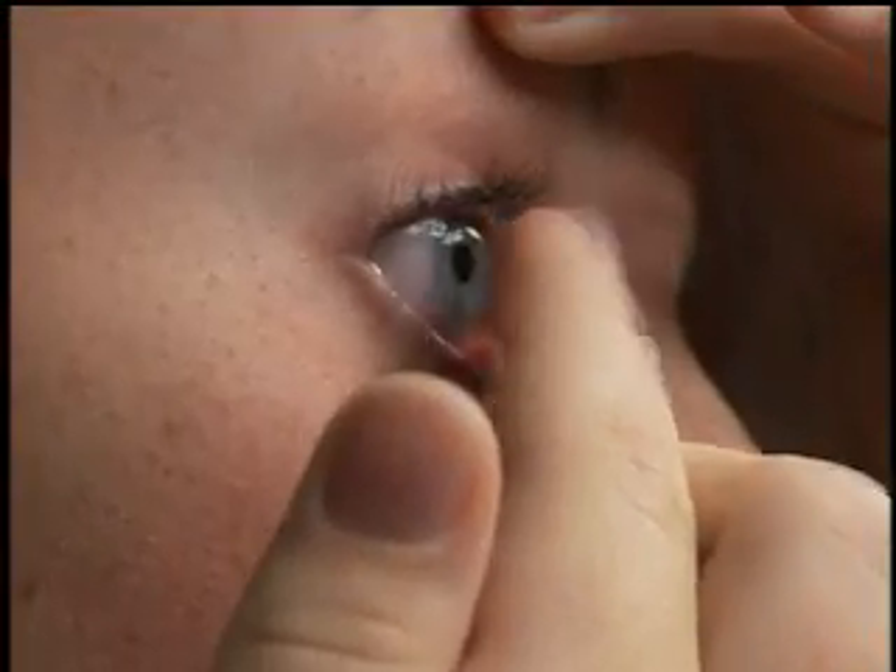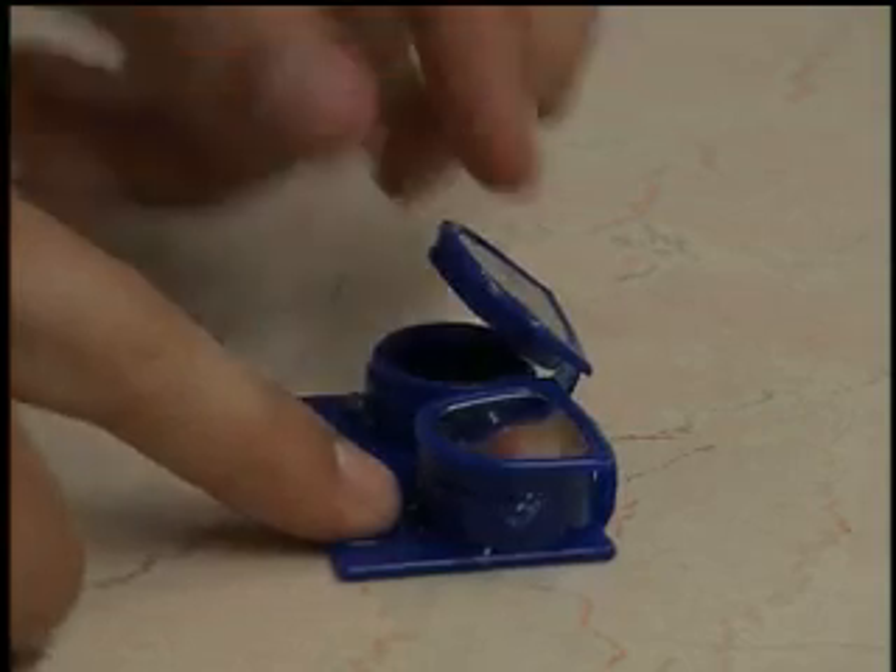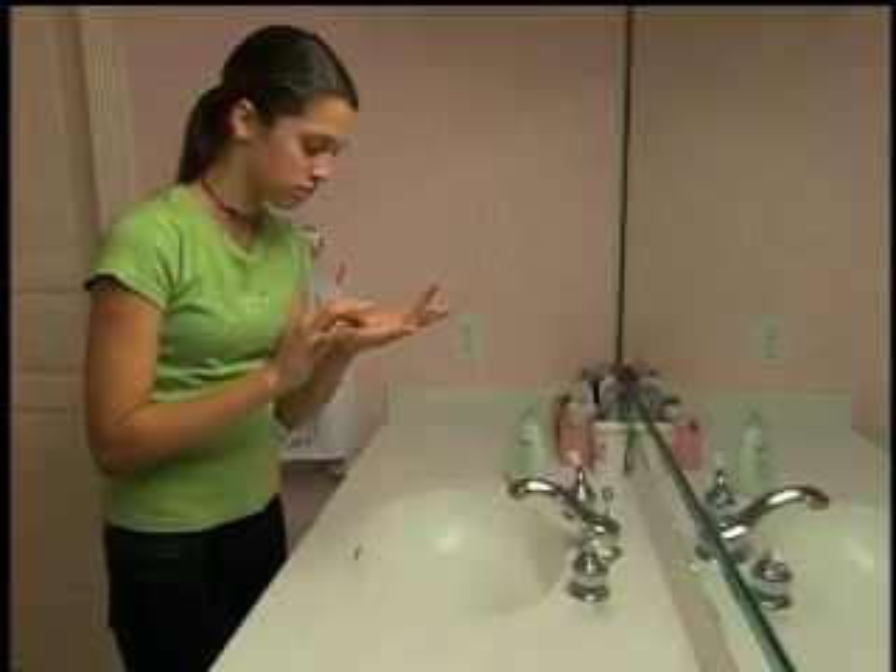Hi, I'm Amanda. I still can't believe just a couple of months ago that was me. Now wearing contact lenses is completely second nature, and the same will be true for you. In the next few minutes, we'll show you how to insert, remove, and take care of your lenses. We're all real people — contact lens wearers just like you — and we're here to give you the confidence you need. Remember, you only have two eyes and they have to last you a lifetime.